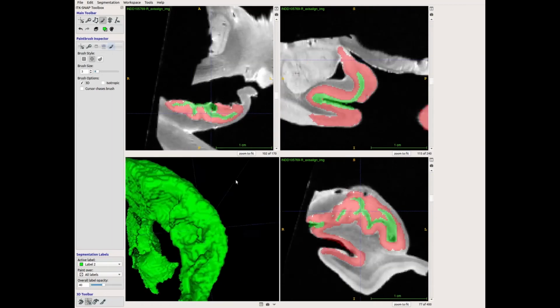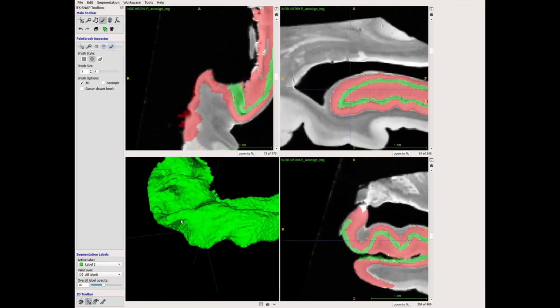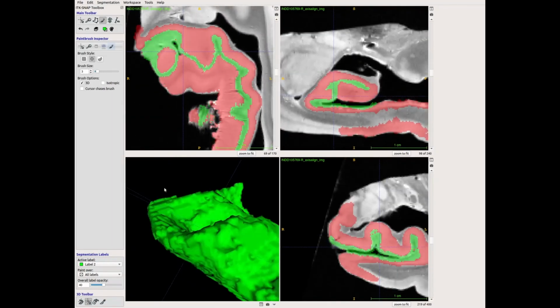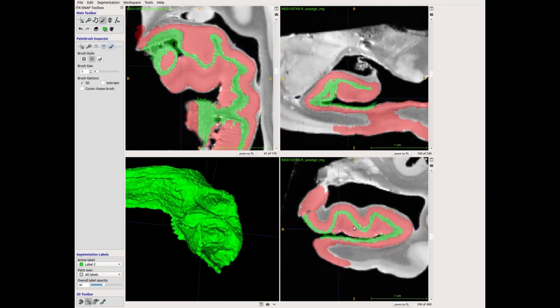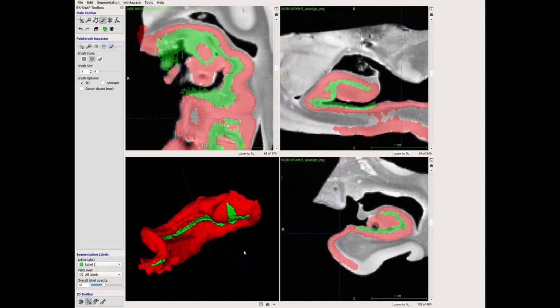Maybe this is a good time to mention we're working on and pretty well ready to release some tools to do this automatically using in vivo MRI images. So check out that project. It's called Hip Unfold. I'll post a link to the GitHub, and hopefully the paper should be coming out soon.